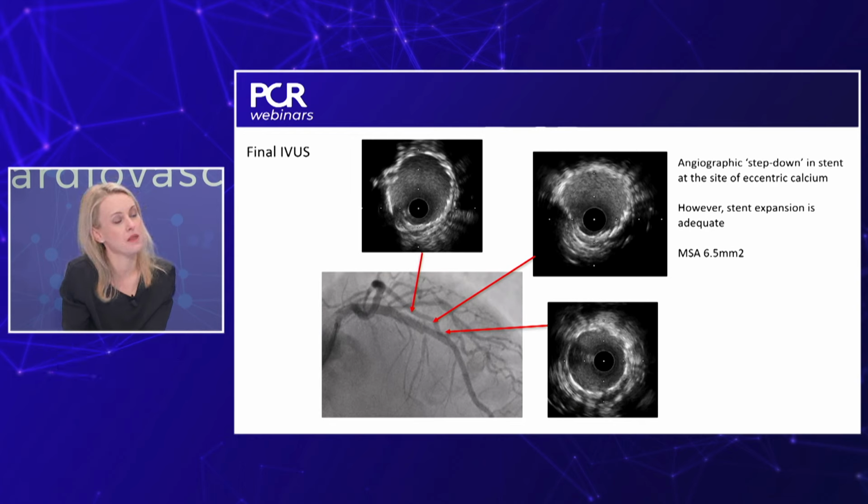Claudio, do you have experience in using the IVL catheter to expand under-expanded stents? To be honest, I failed to evaluate the vessel sometimes. I need to be honest, and it can help. But actually, when you are in that position, you realize you failed. You failed because you didn't do imaging, or you failed because you didn't prepare the vessel. But it can be helpful, and you can avoid stent thrombosis related to under-expansion. And maybe it's safer than an OPN sometimes.